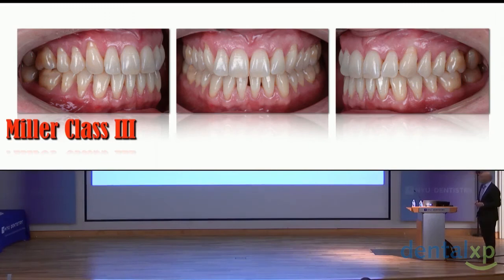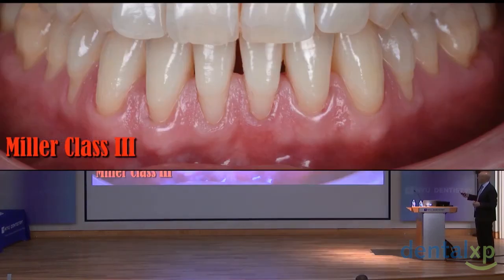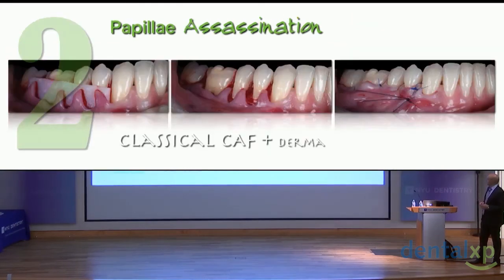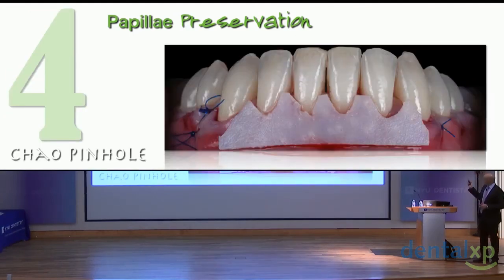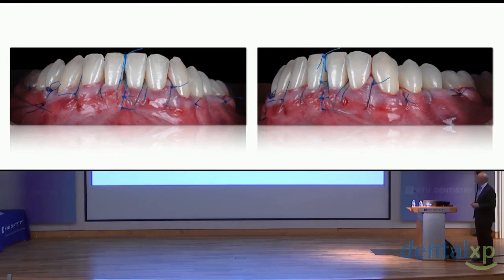This is the situation before. Don't be fooled by this long papilla. I don't have enough bone interproximally. You know that. So on the right side, I used the cuff with the allograft. On this side, I used a classical approach with allograft. On the other side, tunneling, cuff plus allograft. On this other side, the pinhole technique. You know the technique. Suture everything.